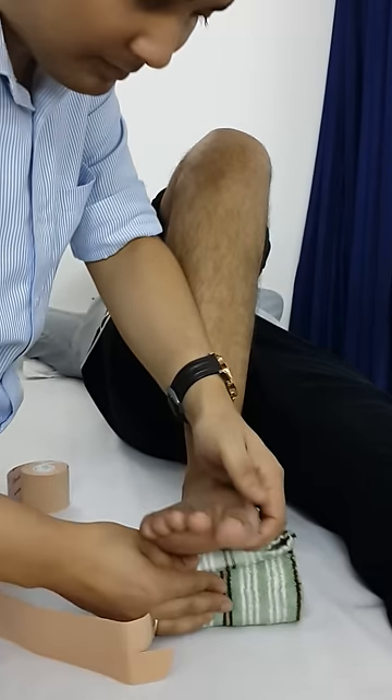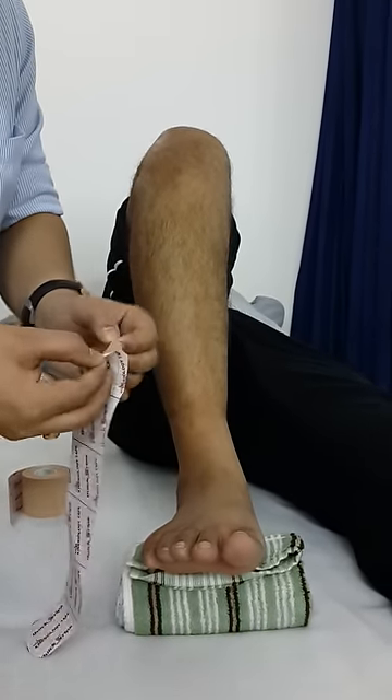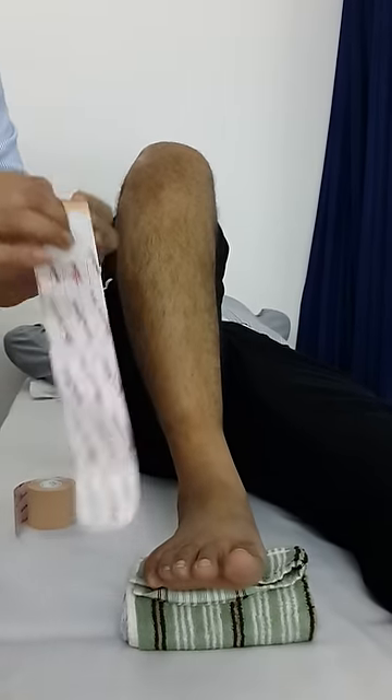Maximum dorsiflexion. And one important thing when doing this: you should not touch the adhesive portion of the strip.